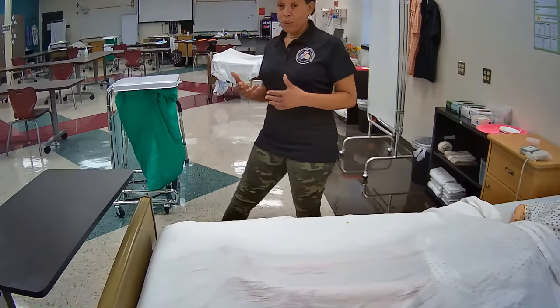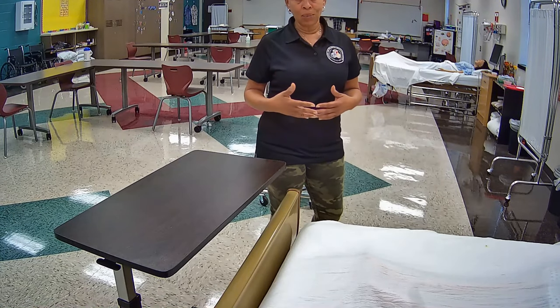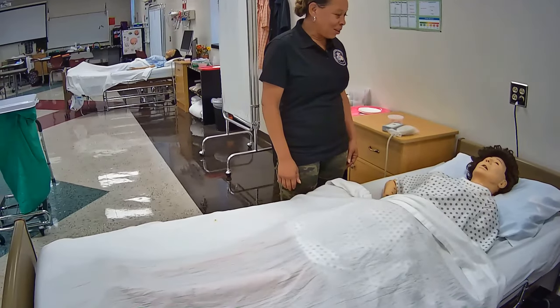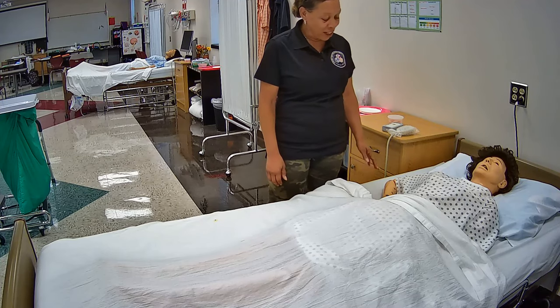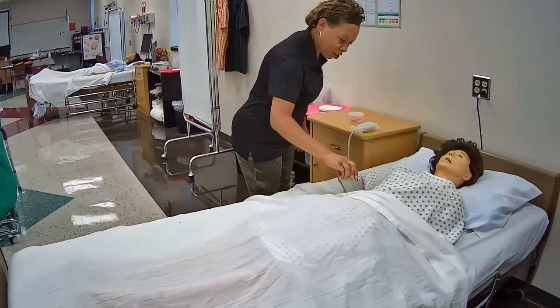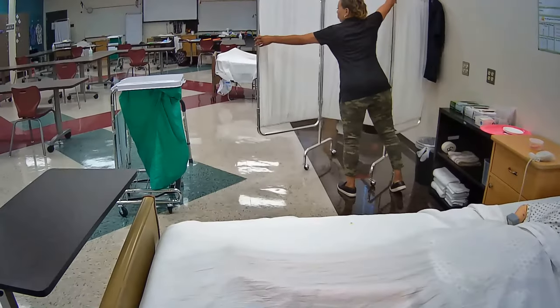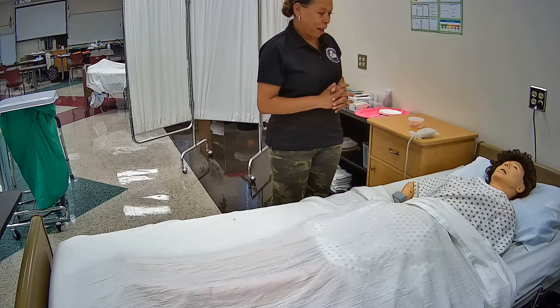As always, you will want to perform your opening procedure. So I'm going to knock on the door, address the resident, introduce myself, and explain what I am doing. Hi, good morning Mrs. Jones. I'm Julie, your CNA, and today I'm going to be cleaning your catheter. But first, I'm going to conduct a brief safety check — I want to make sure your bed is in a low safe position, your bed wheels are locked. Here's your call light. I'm going to provide you with privacy. Now I'm going to go wash my hands and gather my supplies, and I'll be right back.